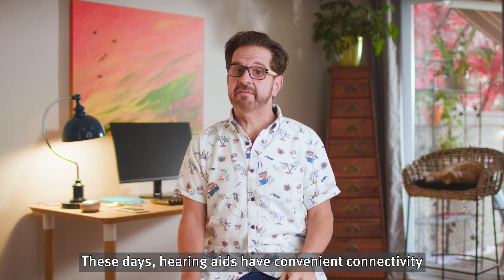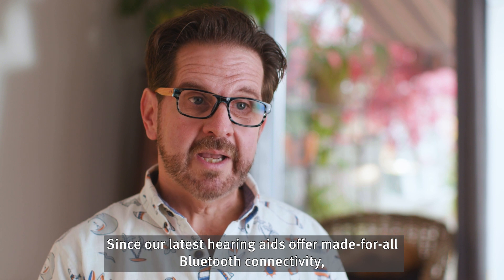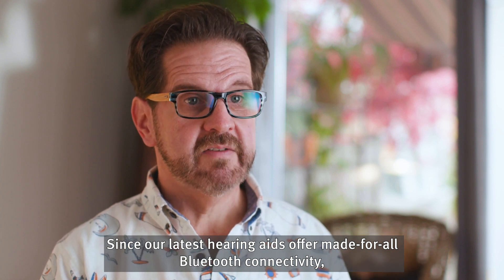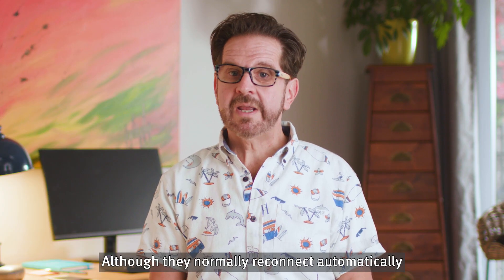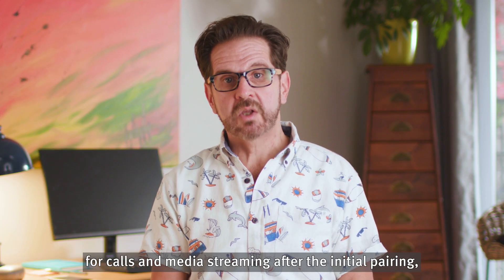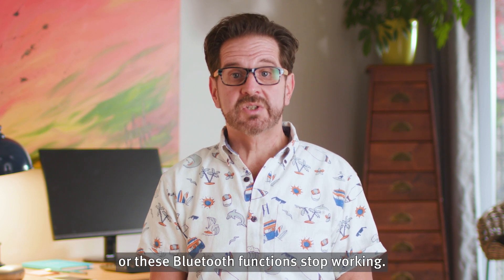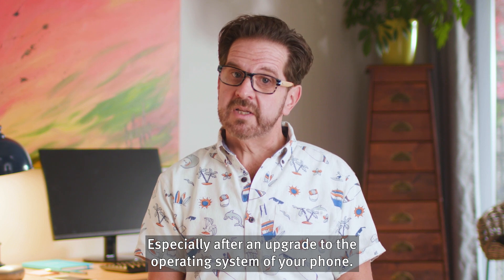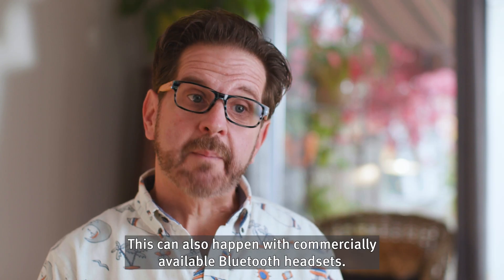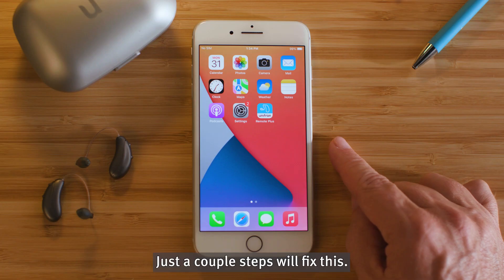These days, hearing aids have convenient connectivity options to broaden their reach and usability. Since our latest hearing aids offer made-for-all Bluetooth connectivity, they work with either Android or Apple phones. Although they normally reconnect automatically for calls and media streaming after the initial pairing, once in a while it could happen that the connection is lost or these Bluetooth functions stop working, especially after an upgrade to the operating system of your phone. This can also happen with commercially available Bluetooth headsets. Just a couple steps will fix this.